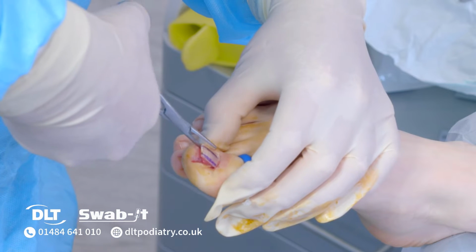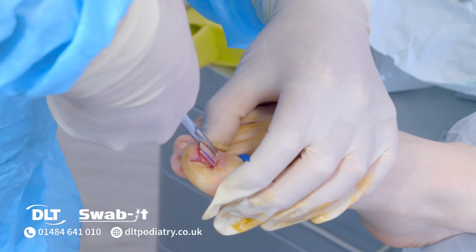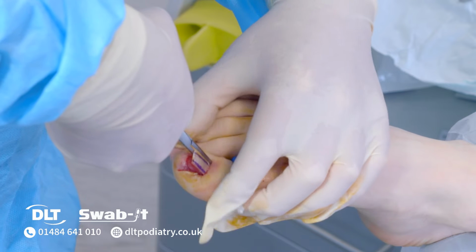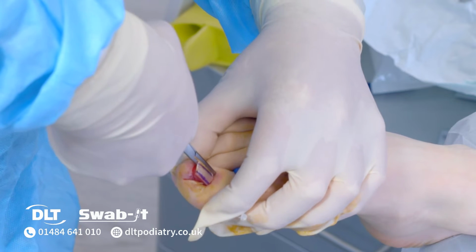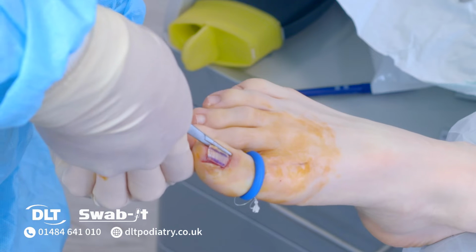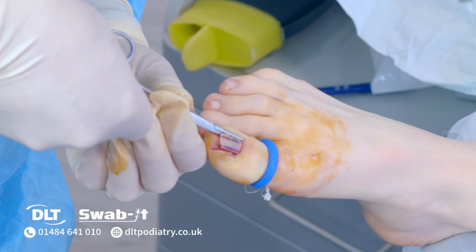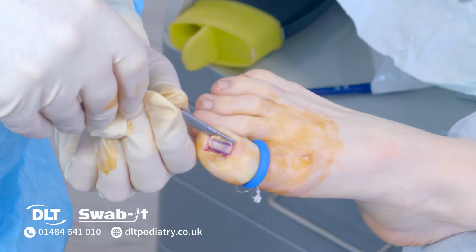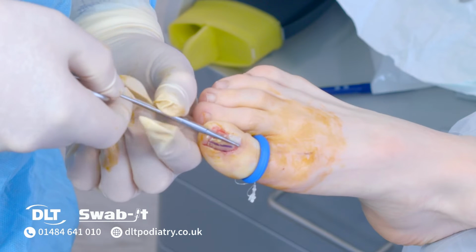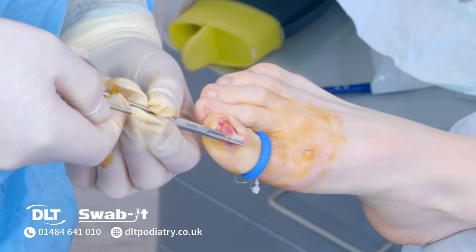Get your elbow vertical. And what you need to do is to make sure that you get right in that corner. When you're under the eponychium, grasp and change your grip and rotate again to the midline of the nail.